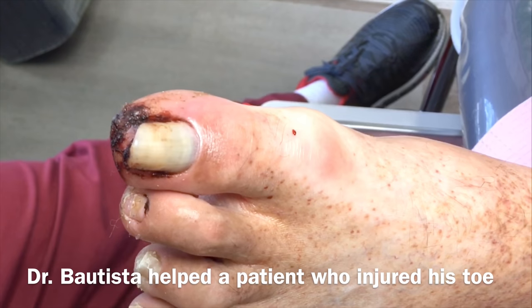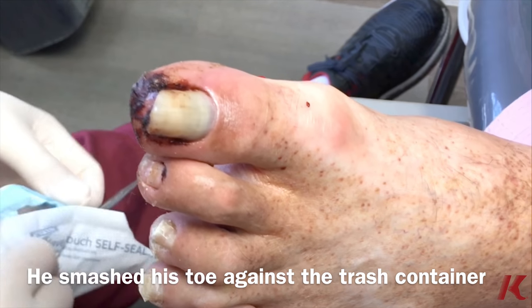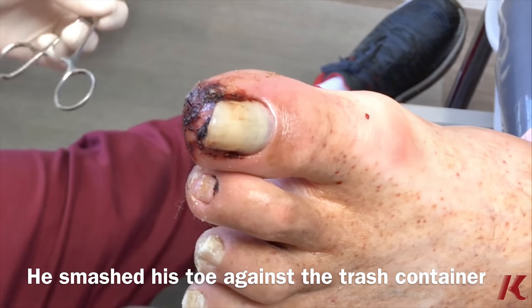The patient injured his toe two days ago, smashed it against a trash container, and about 90% of the nail looks like it's been separated.